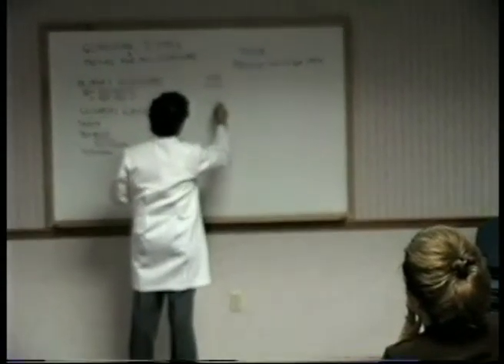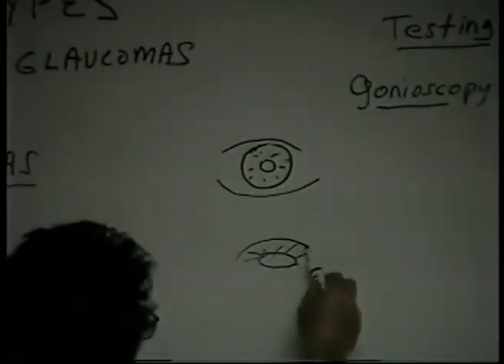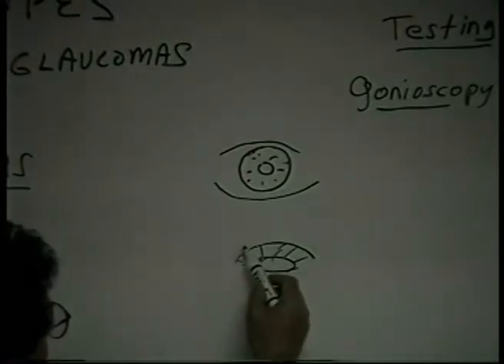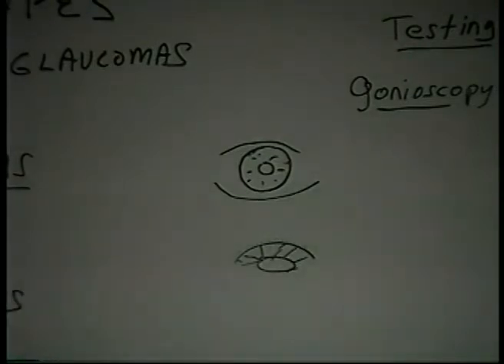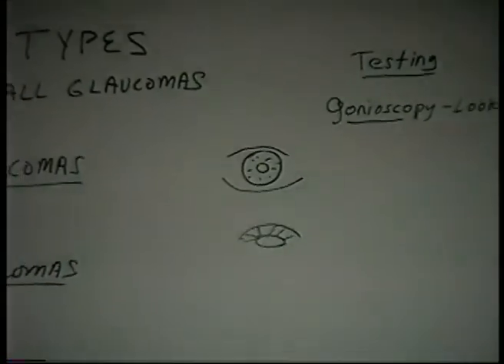we see the pupil as if we're sitting inside the eye looking toward the drain. And we see the pupil coming out, and we see the cornea coming down, and we see that circular area where they come together. Now the drain is sort of like a slit. It usually has a little pigment in it. And we look at it, and we can see pretty quickly whether it's open or closed. It's not a very hard distinction. When it's wide open, it's not a hard distinction. And then you can know right away whether the angle is open. And that helps classify the glaucoma into the different types.